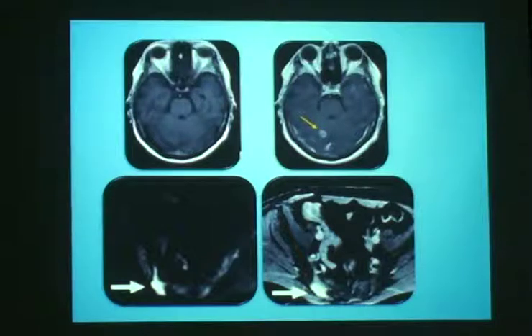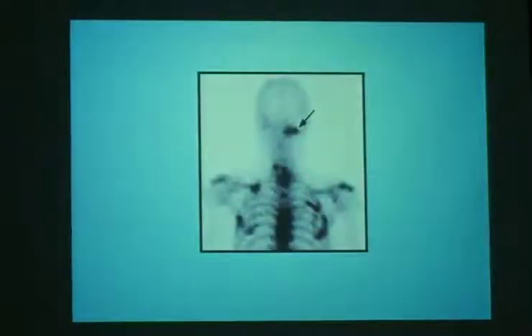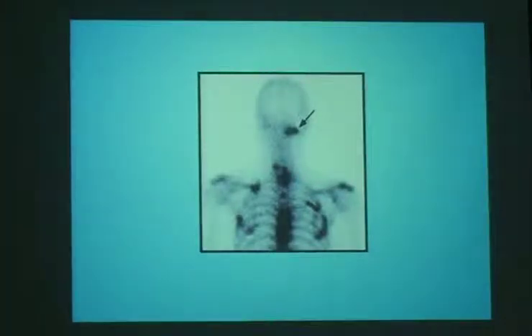Now, based on the MRI findings, we wouldn't have an interpretation or an answer to the patient's current symptomatology of the excruciating occipital headache and the drooling. But by this lesion that was detected on the bone scan, and that's why I said at first that the sensitivity of bone scan in the detection of calvarial and rib cage lesions is much higher than MRI. This was a metastatic lesion that is seated at the occipital condylar region, implicating the course of the hypoglossal nerve through the hypoglossal canal, according to the anatomical location.